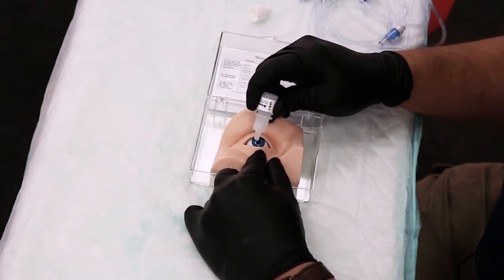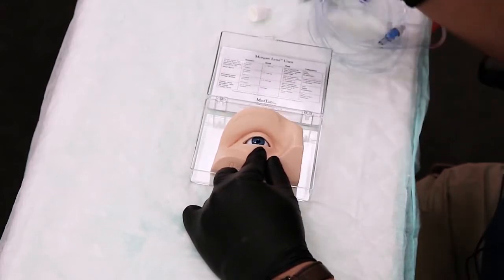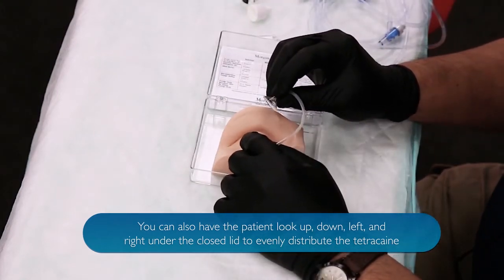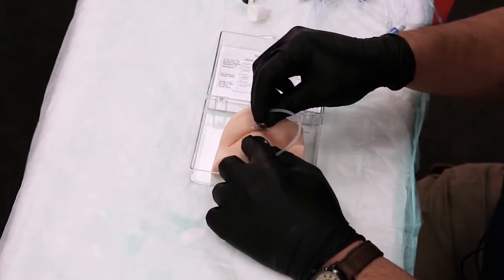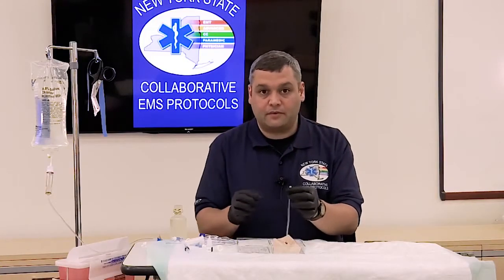We want to apply two drops to that area between the sclera and the lower lid, and once those two drops are applied we can then go ahead and insert the Morgan lens. You want to wait for a good 20 to 30 seconds until that numbing effect has kicked in, and once you put that in, the end of this will fit on a regular luer lock.